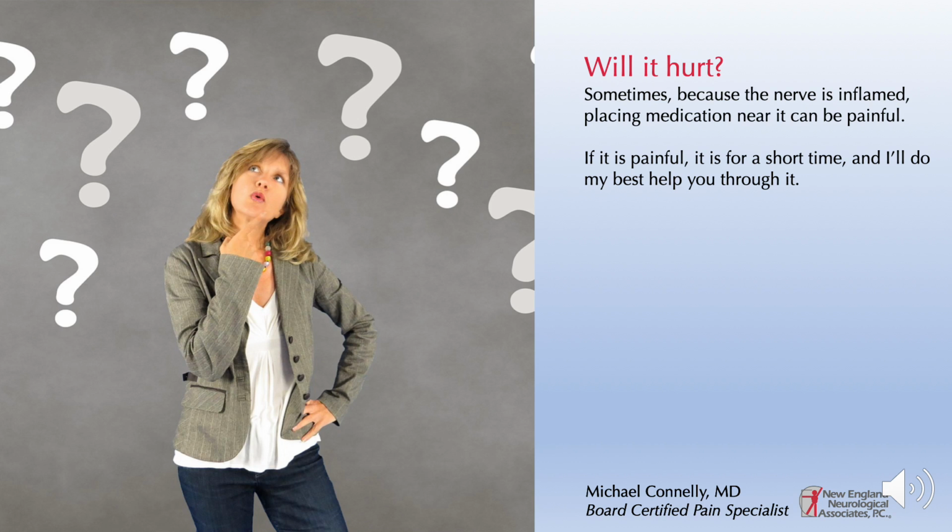The most common question is whether the injection will hurt, and the answer is sometimes it hurts because we're putting medicine on a very painful or tender nerve, so just being near it can be painful. Oftentimes, however, people find it to be comfortable and relatively easy to have done.